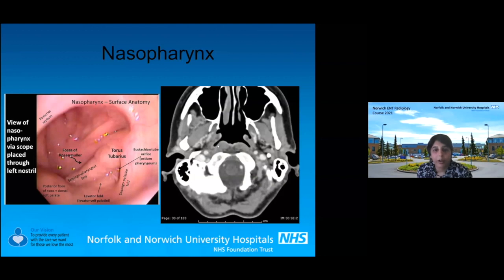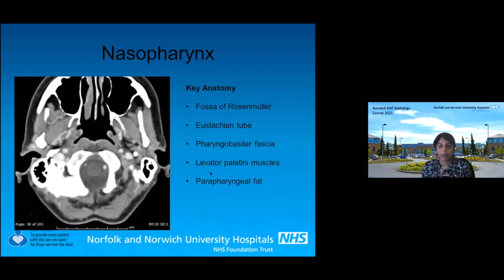This is the fossa of Rosenmüller, the posterior structure which is what you see when you look up through a scope. This is the torus tubarius, which is the cartilaginous portion of the eustachian tube. And this is the eustachian tube. I've labeled the key things we look for on cross-sectional imaging as radiologists.